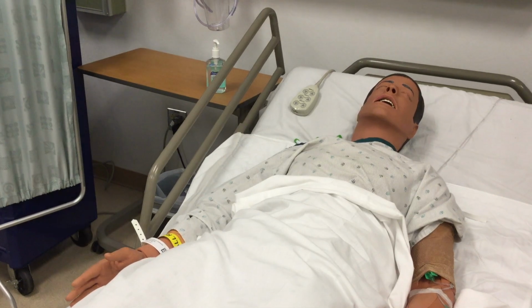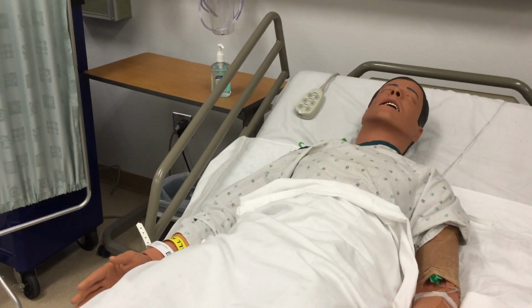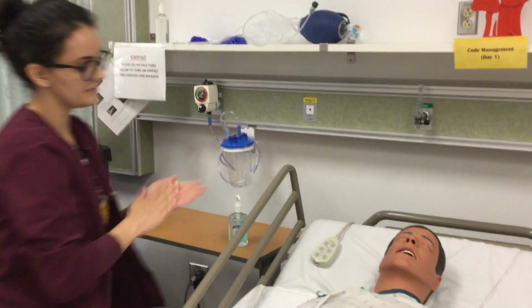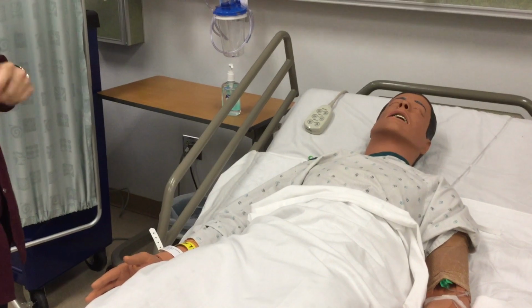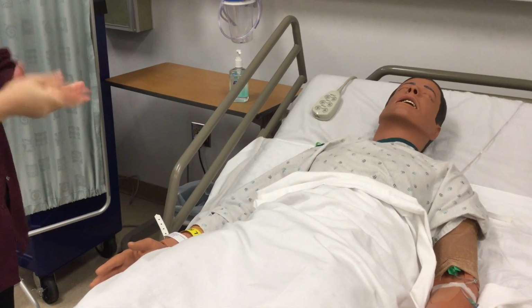First, introduce yourself to the client, provide for privacy, and perform hand hygiene. Come in. Hello, I'm Kayla. I'm going to be your nurse today. Hello. Remember to verify the patient with 2 identifiers and MRN number. Check for allergies and fall risk.